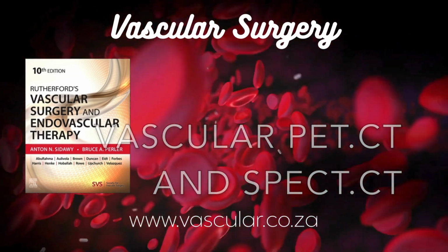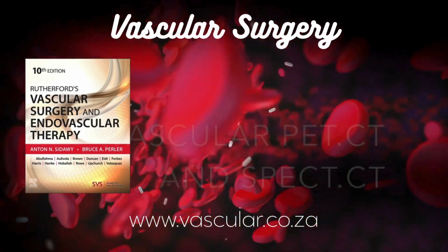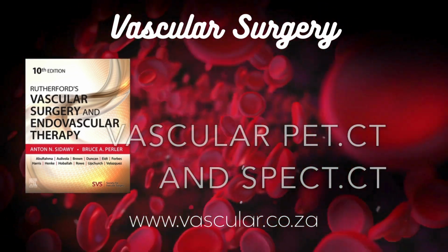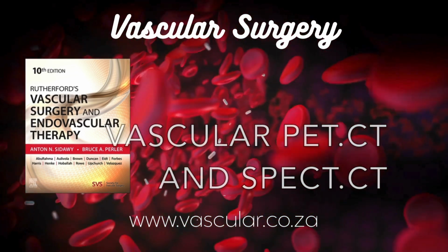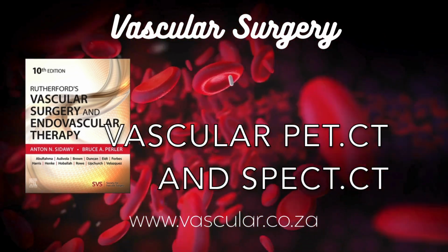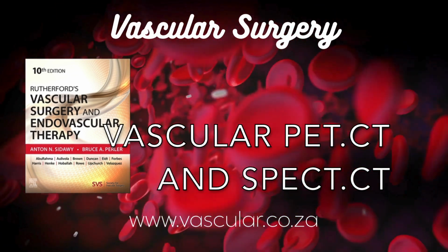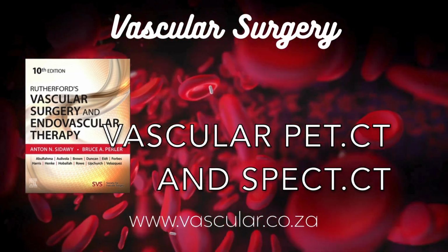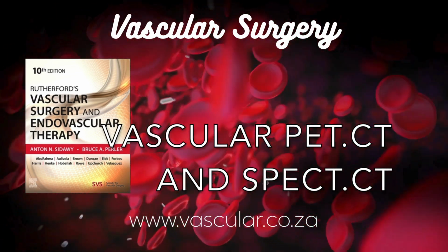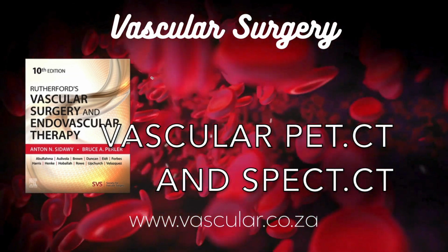A very strong link. And other studies using combined PET-MRI have found increased FDG uptake in plaques of patients who've had strokes, even in plaques that weren't causing severe narrowing. So it's not just about how blocked the artery is. Precisely. It's about how angry the plaque is, how inflamed. Plaques considered unstable on ultrasound or MRI, those with a large lipid core, internal bleeding, or that look dark on ultrasound, they consistently show higher FDG uptake. So FDG-PET helps identify the potentially dangerous inflamed plaques, not just the big ones. That's the crucial idea. It's adding a layer of biological information to the anatomical picture.